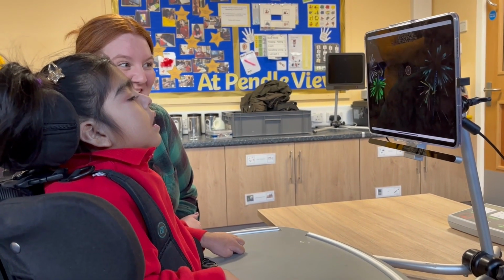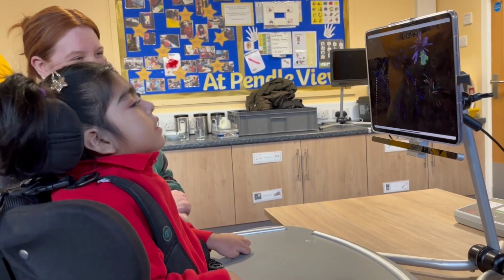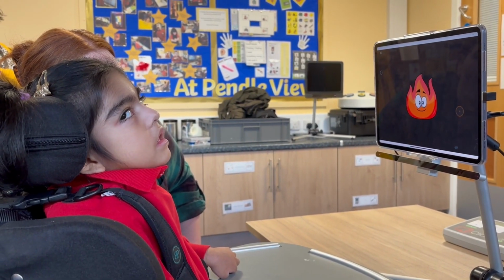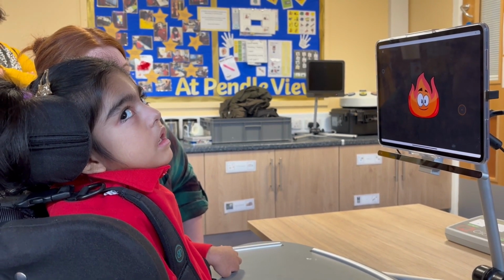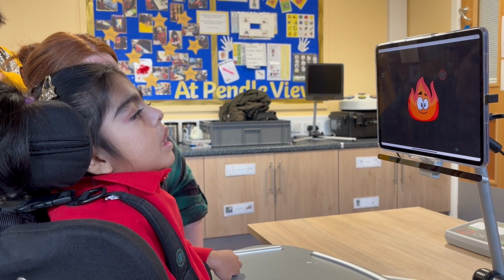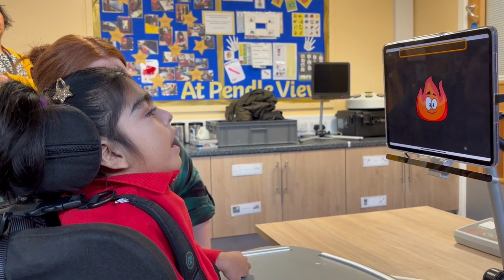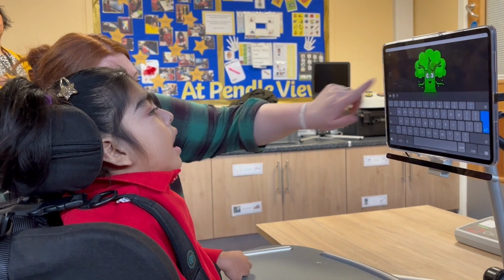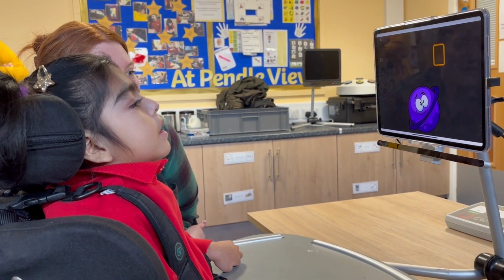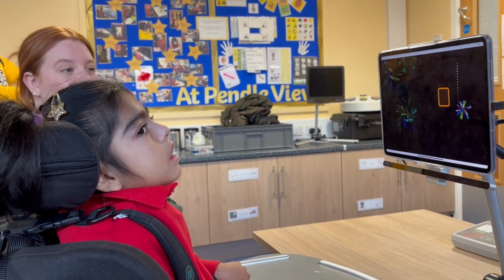That was quick. Oh my goodness! Very quickly. I think we might need to take you up a level. Yeah, I think so. We should get this one. Are you listening to Ian? Yeah, don't listen to me. Oh, where is it? Where's it gone? Oh, how have you done that? Pesky keyboard. Oh, there you go. Wow. You're gonna roll now. Wow, clever. Well done.